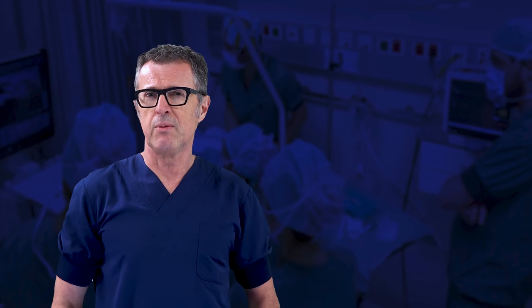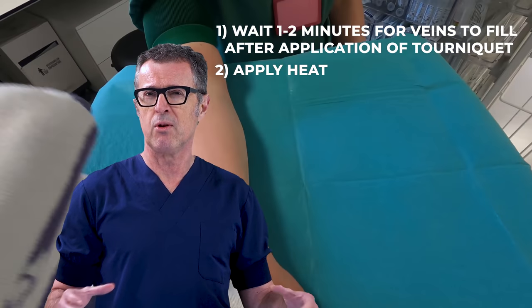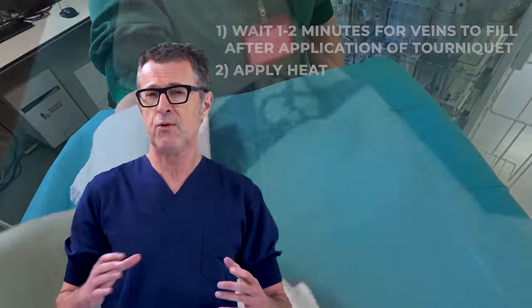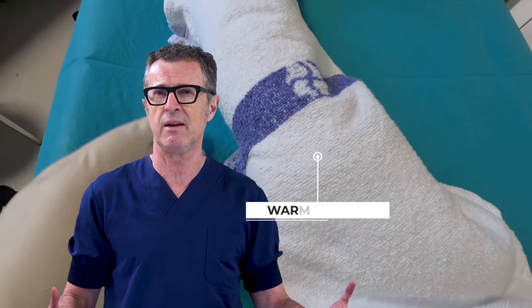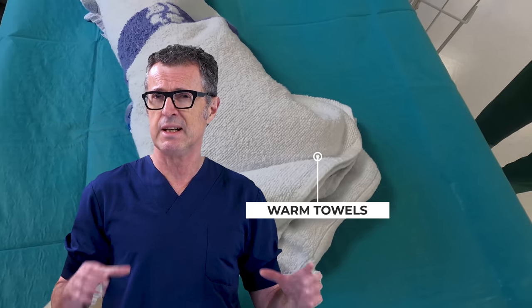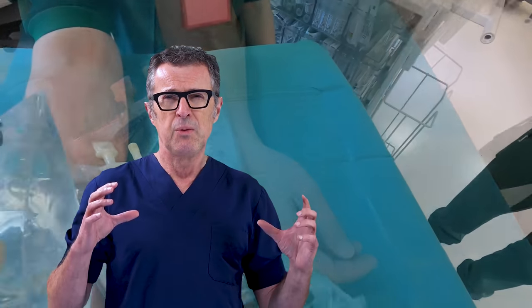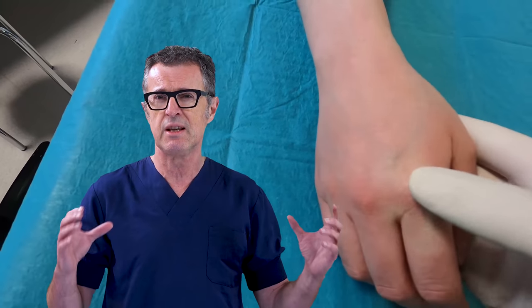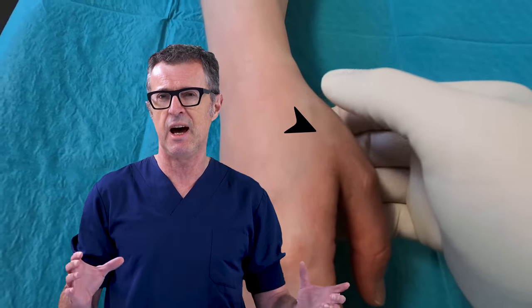Advice number two: apply a warm towel, warm compresses, or a heating device such as a bear hugger or similar to help the patient relax and vasodilate. This, in addition to allowing time for the veins to engorge, will also substantially decrease the patient's stress and reduce the vasoconstriction caused by stress and cold. So you are accomplishing several different things that will facilitate IV cannulation.